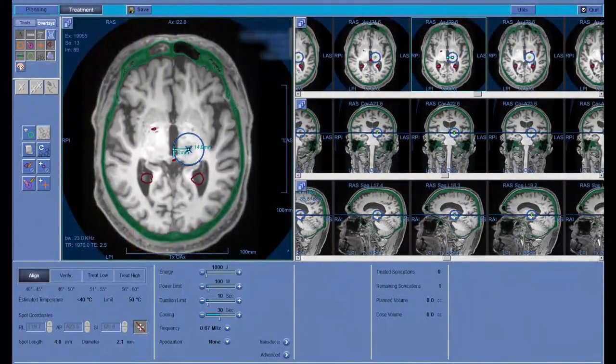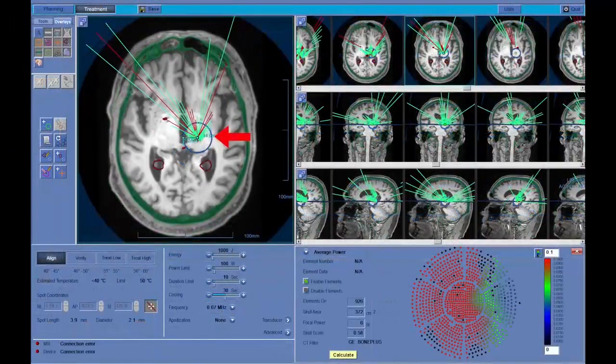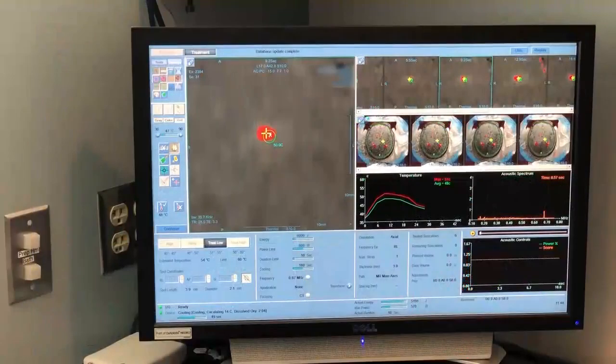The treatment phase involves 3 stages of sonication: focus alignment with target peak voxel temperatures of 40 to 45 degrees Celsius, target verification at 46 to 55 degrees Celsius, and therapeutic ablation at 56 to 60 degrees Celsius. The amount of energy that should be prescribed for each sonication is dependent on the desired target temperature. Note that the natural focus of the transducer, individual paths of ultrasound energy, and power from each respective element can easily be visualized. Intracranial heating caused by each sonication is assessed using MR thermography.